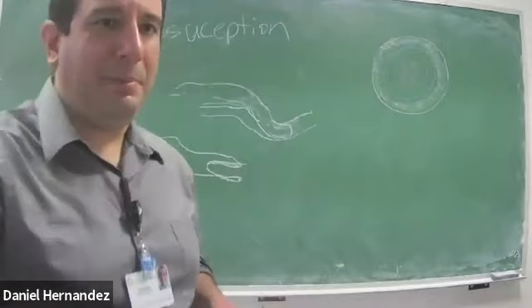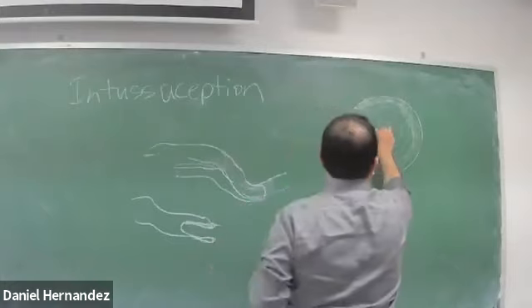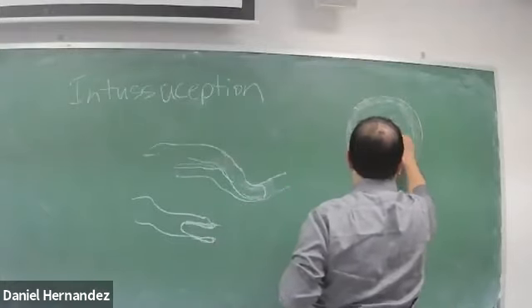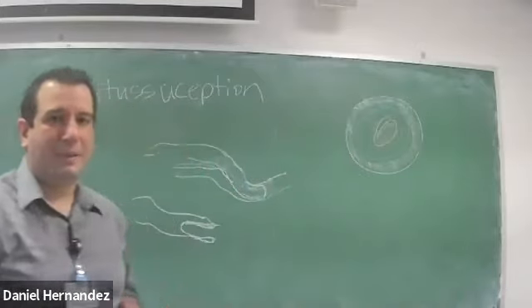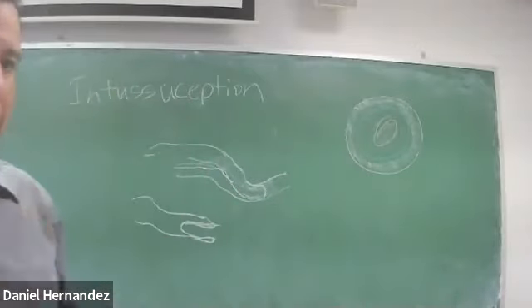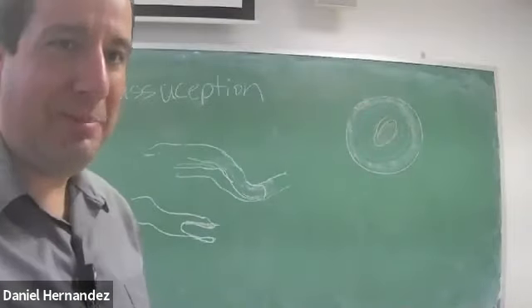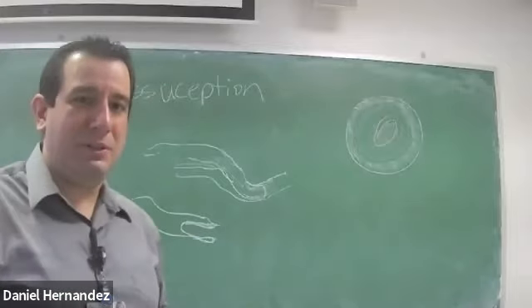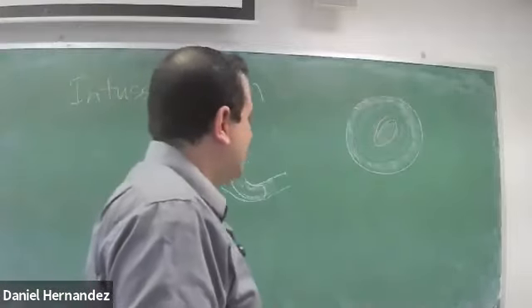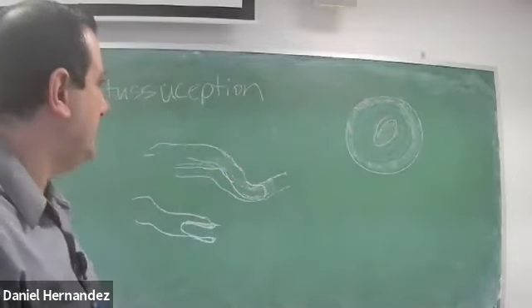This is going to look like a big donut like that. It'll stand out right away. It'll catch your eye, I promise you. If this patient has a large intussusception, you will notice it. It's just up to you to be careful, make sure you're scanning through that entire abdomen.